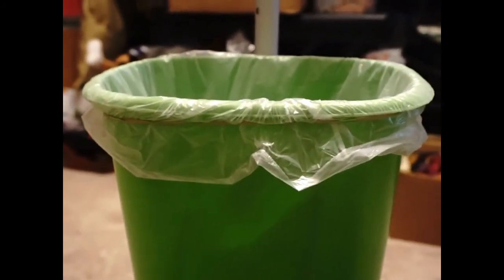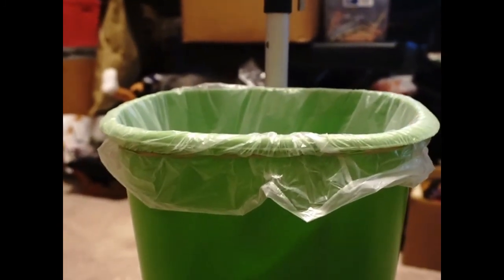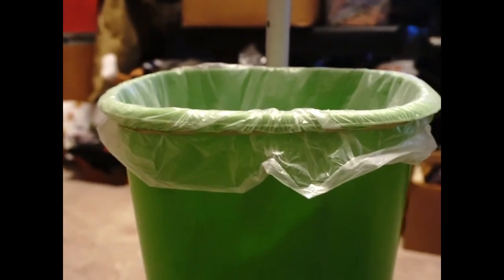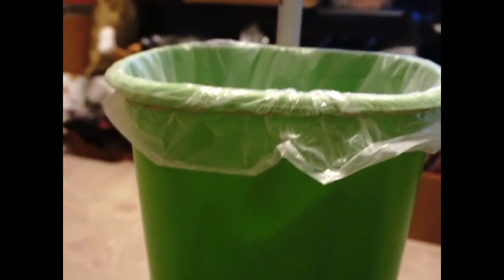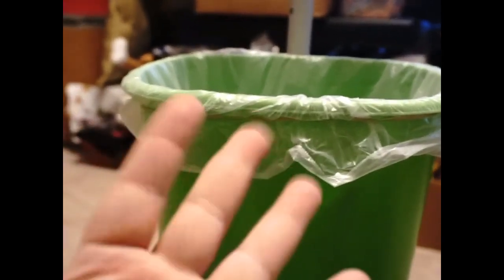And now you have yourself a garbage can attached to an IV pole. I know it's not the best video — I may do a better tutorial when I'm feeling better — but I think it's pretty self-explanatory. If you have any questions just ask; I have no problem answering them. I hope this helps, have a good day, bye!